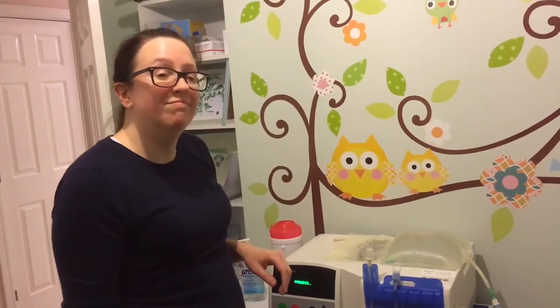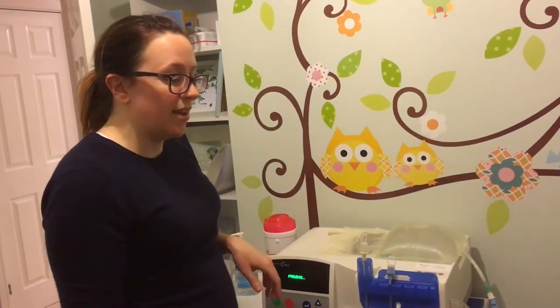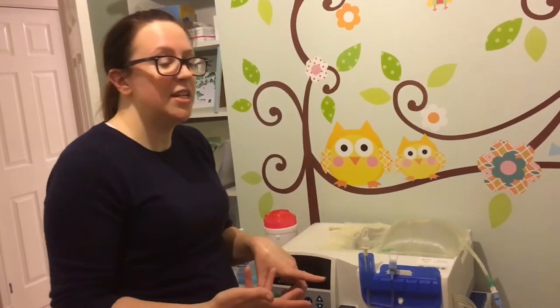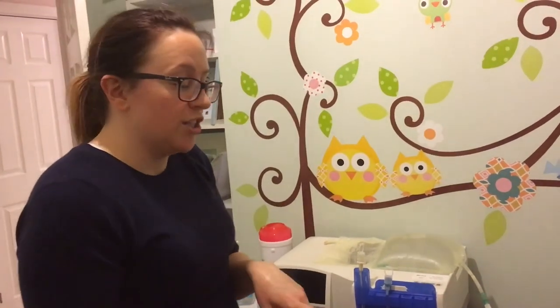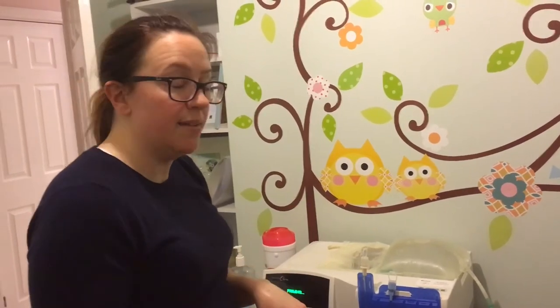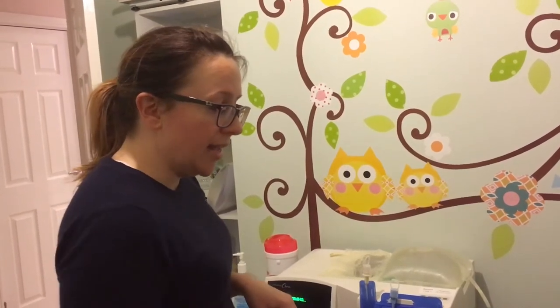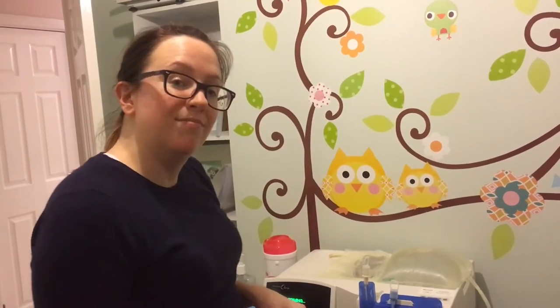So that usually takes about five minutes, so that gives us some time either to read to Ethan, put his feet on, attach his foot to his oxygen monitor — or today we're going to change his dressing. The dressing has to be changed every other day, and today's one of those days. So since we've got a little bit of time while it's priming, that's what we're going to do next.